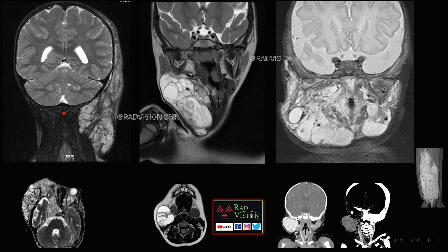The second case shows a similar-appearing cystic lesion with multiple septae and sometimes fluid-fluid levels. This is a cystic lesion in the neck in a child with fluid-fluid levels, classical of lymphangioma. The third cystic lesion in the neck, with multiple cystic spaces showing flow voids and sometimes phleboliths, is a hemangioma.